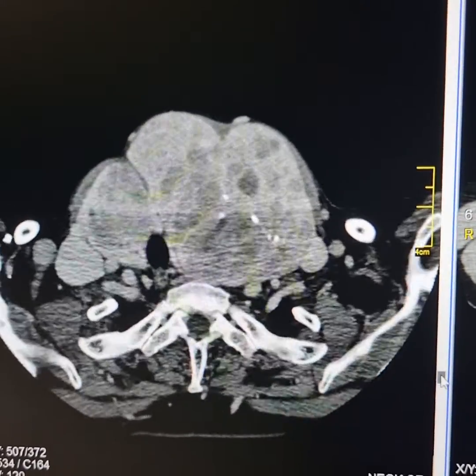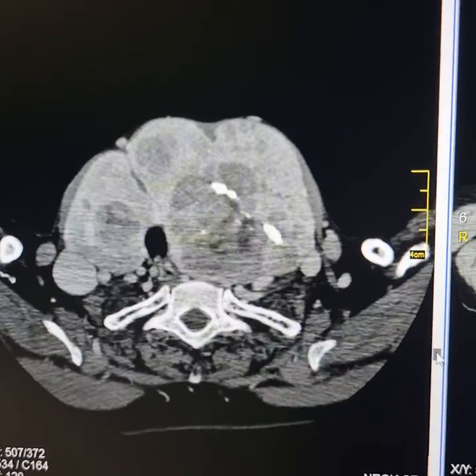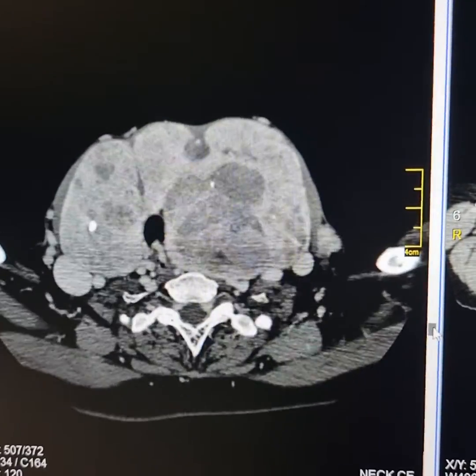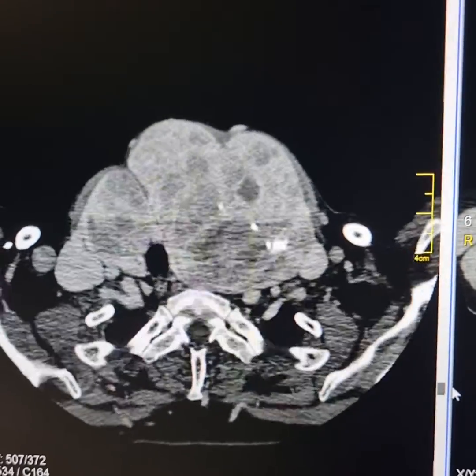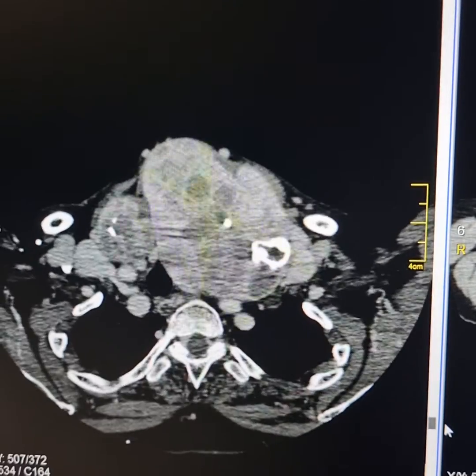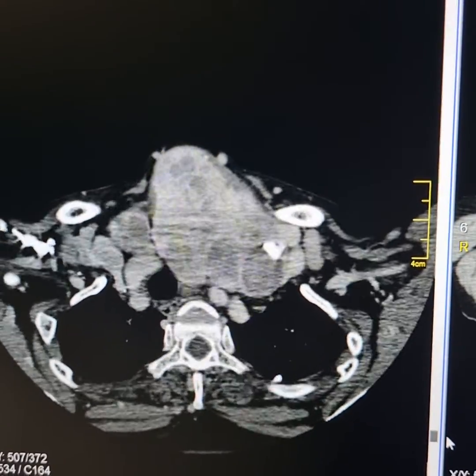Adjacent blood vessels are displaced with distinct interfaces. Apparently there is no malignant transformation of any of the nodules.